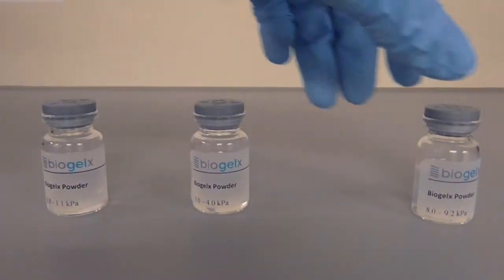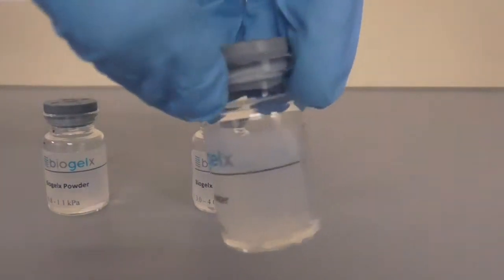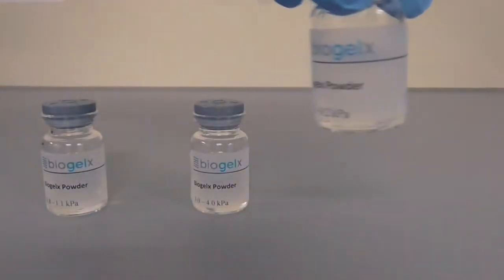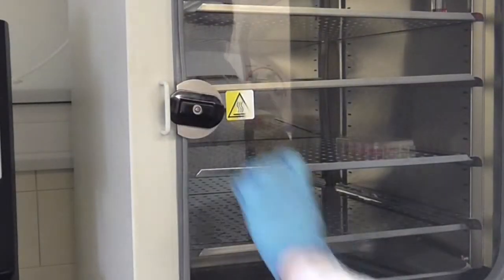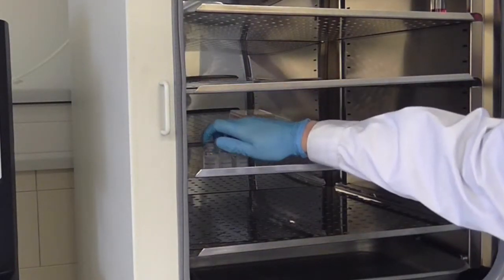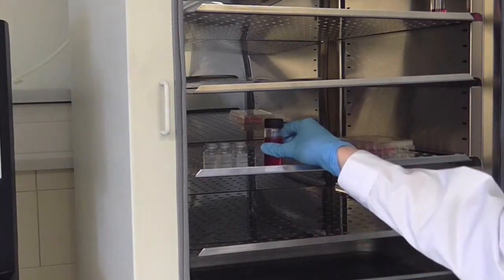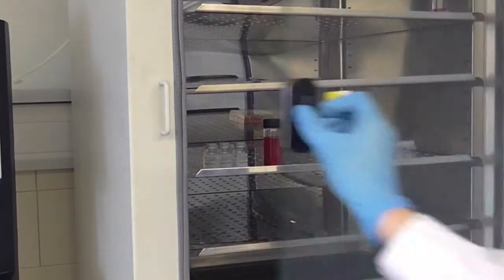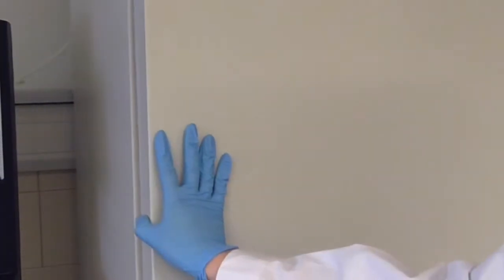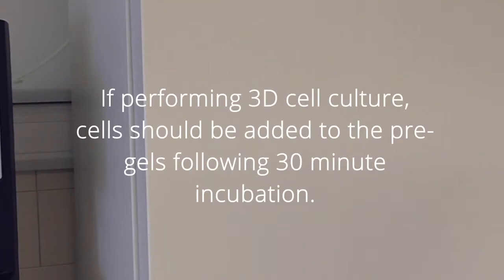If any air bubbles are present in the pre-gel solution, remove these by applying sonication to the solution for approximately 10 seconds. Prior to use, place the pre-gel solution and cell media in an incubator or water bath for 30 minutes until the solution reaches 37 degrees Celsius. If performing 3D cell culture, cells should be added to the pre-gels following 30 minutes incubation.